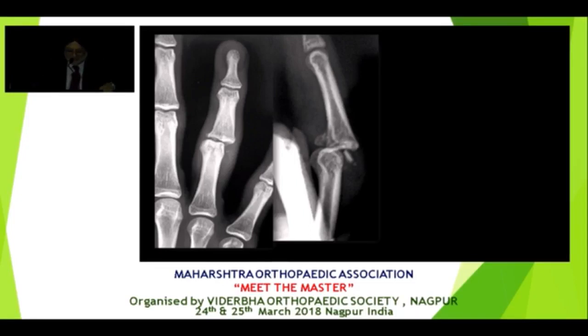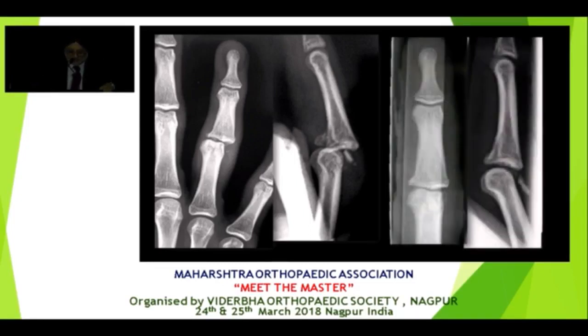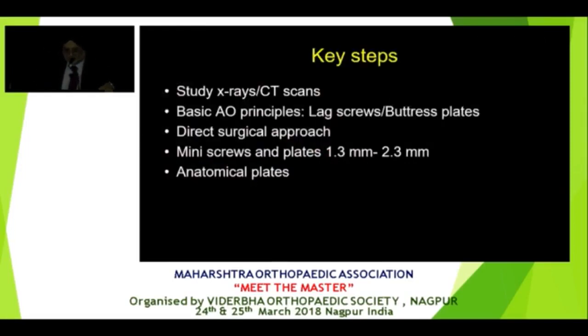So here is this fragment of bone sitting there. When we reduced it in the ED, they sent him to my follow-up clinic 2 days later, and this fellow has got this piece of bone that's sitting out there. And it makes no sense because with a dorsal dislocation, you expect a small volar fragment. You don't expect a dorsal fragment. We'll come to this after understanding what happens with these fractures.